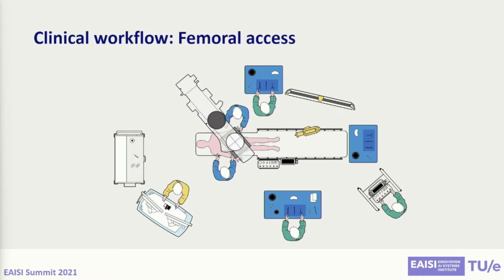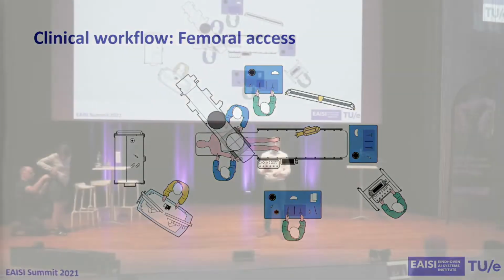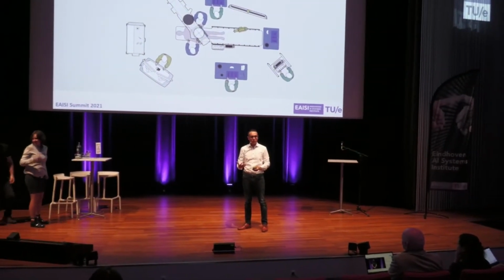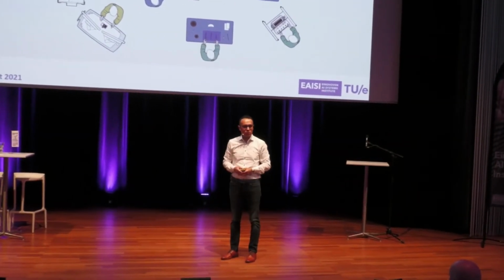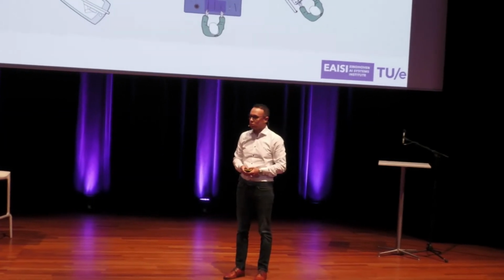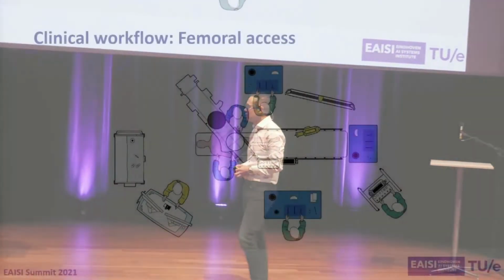So just the starting position, if we just want to automate the starting position, you can see that it is actually quite a tricky task. It is going from the parking to a different position according to the preferences of the doctor. So how can we address this?